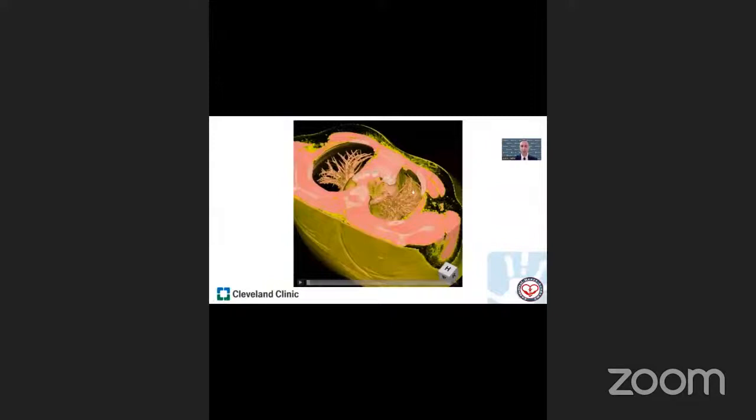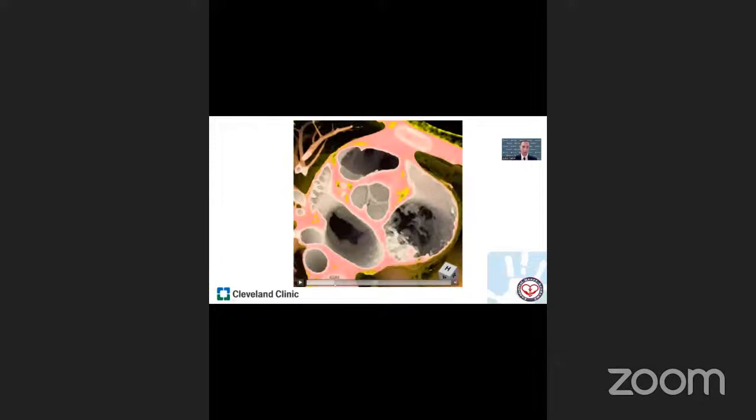Before we look at a CT data set of a patient with isomeric atrial appendages, let's first briefly review normal cardiac anatomy with usual atrial arrangement. So this is a CT data set of an adolescent patient. And as we start to dissect into the heart, we can appreciate the base of both atrial appendages on the left and the right side.